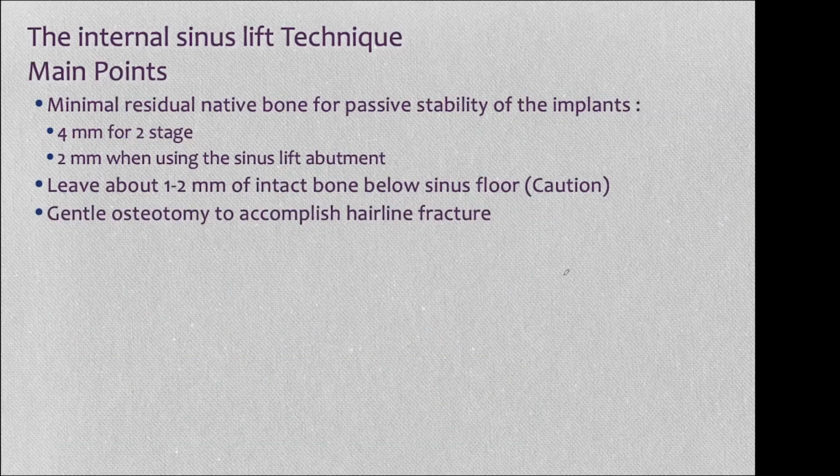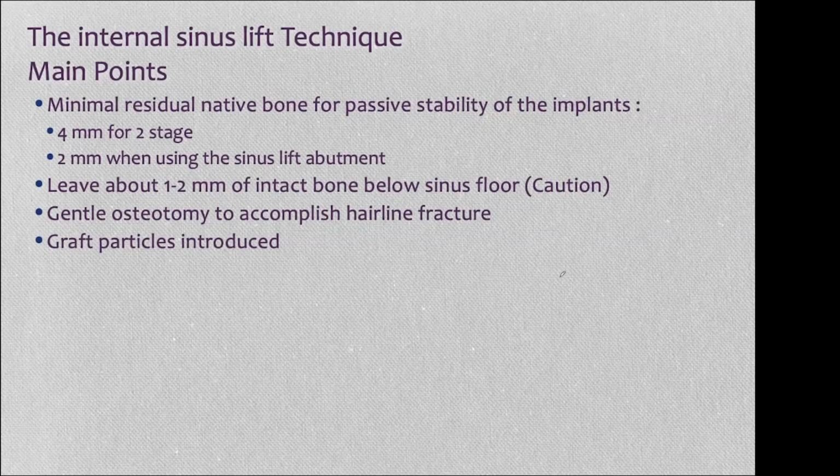The edges of the osteotomy come together. That's the shape of the apex of the reamers, and so that comes to a funnel. And so you would still need to fracture them. Otherwise, they will not allow the implant to move relatively freely. You need to use a lot of hammering, which is very unpleasant to the patient, to seat your implant. So I advise that you use an osteotome, the round sinus floor osteotomes, then introduce your graft particles.